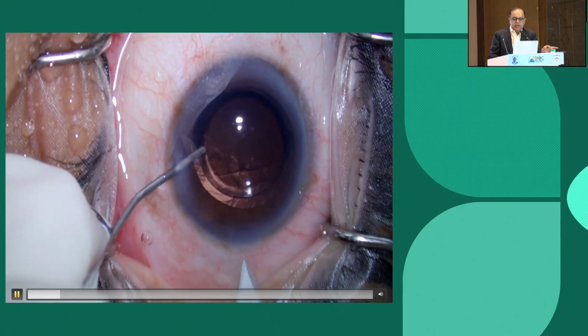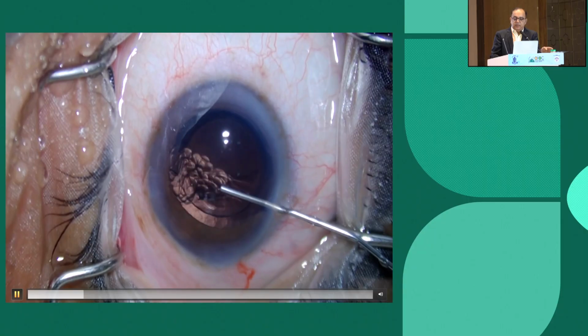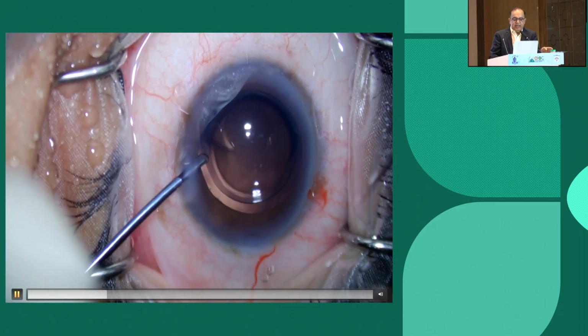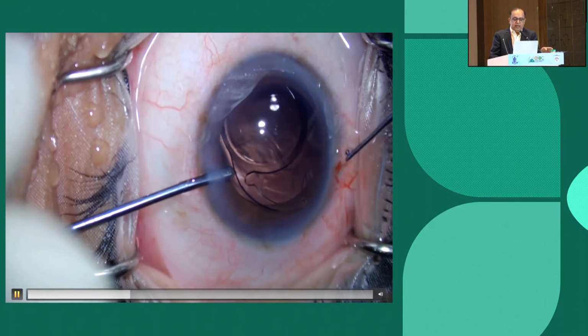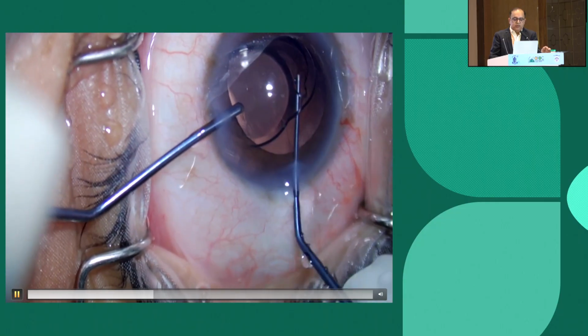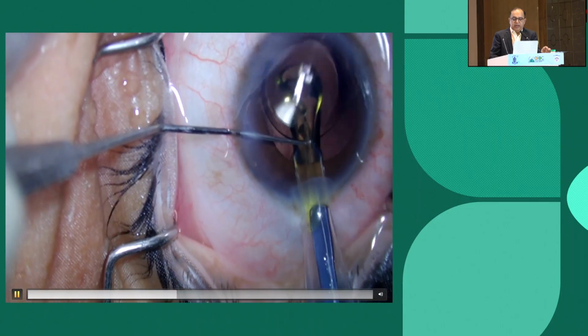The first surgery was done 1 week back before the patient was taken again for surgery. The IOL placed was 18 diopters instead of 23 diopters. The main incision is slightly extended internally, using dispersive viscoelastic to coat the endothelium. With the help of a dialer and repositor, the IOL is brought out of the bag in an atraumatic way, taking care not to cause bleeding from the iris.